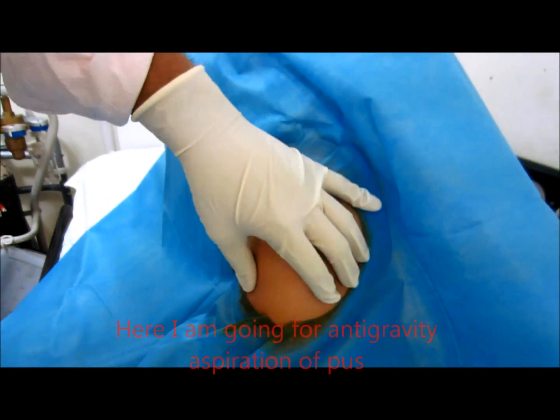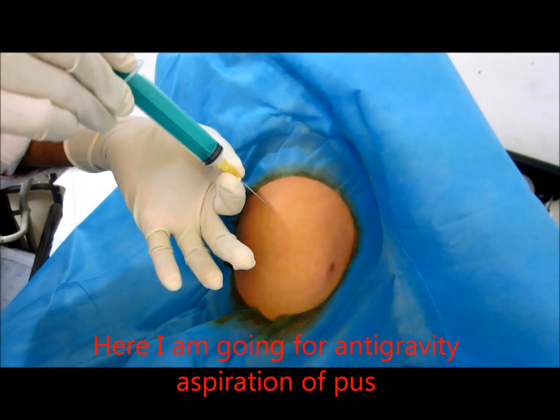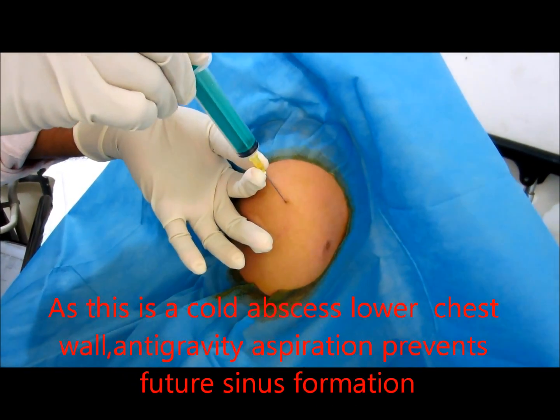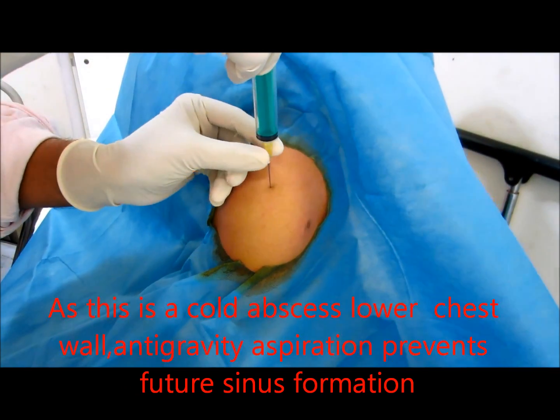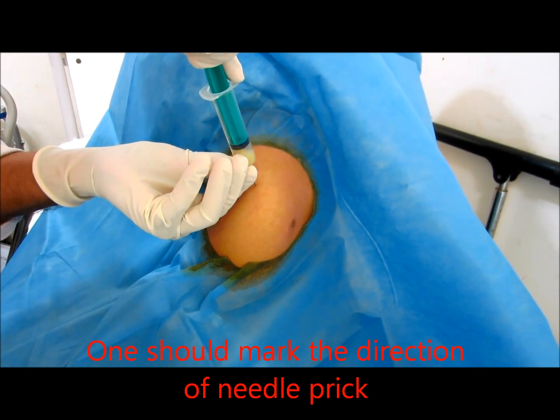Going for an anti-gravity aspiration of the pus. Watch the angle of needle piercing — in all cold abscesses, aspiration should be done in an anti-gravity fashion.